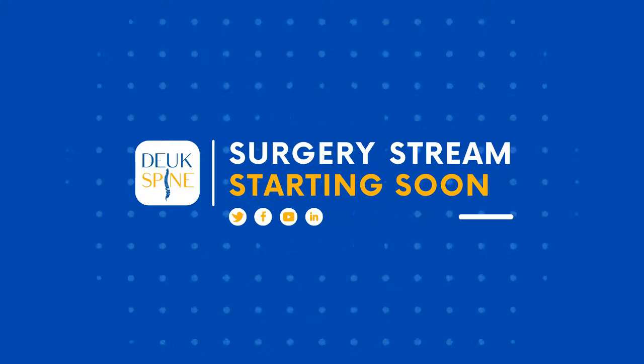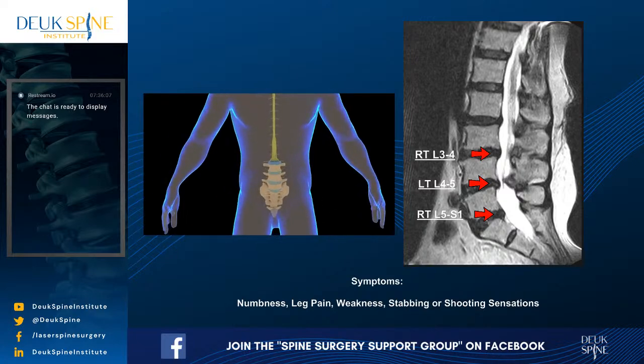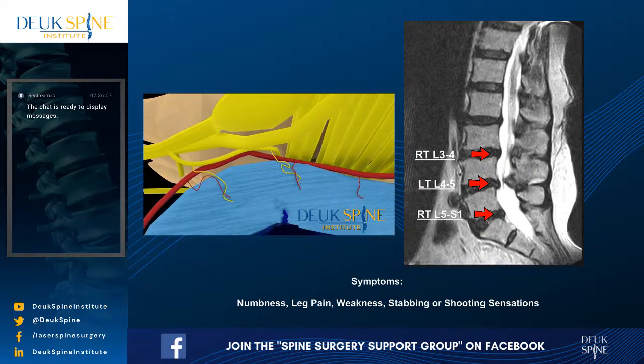And I'm here at the Deuk Spine Institute and Surgery Center. We're getting ready to perform our first surgery of the day. We live stream all of our surgeries so you can watch and ask questions. We'll be performing a repair of 3 herniated discs in the lower back.